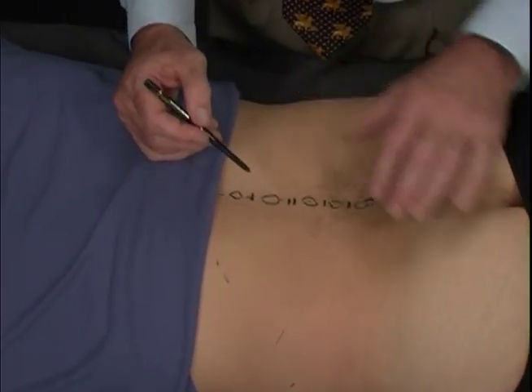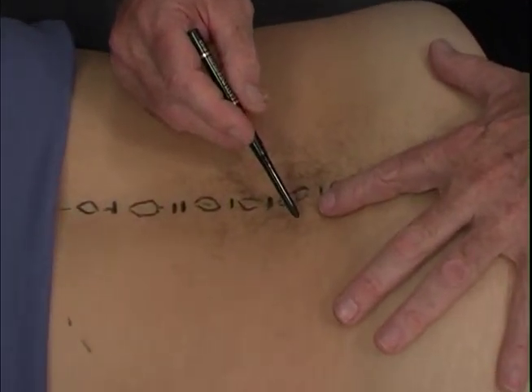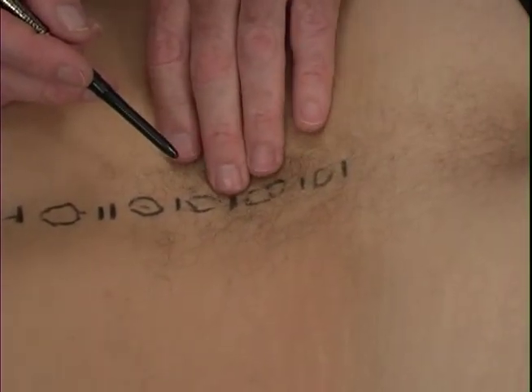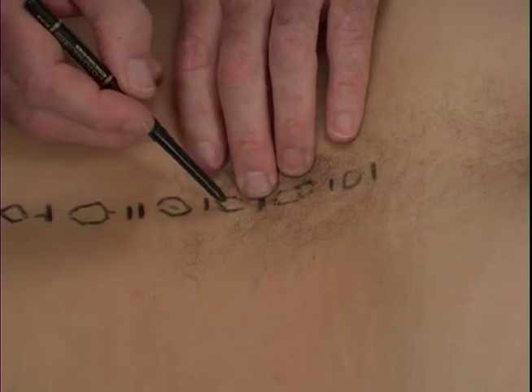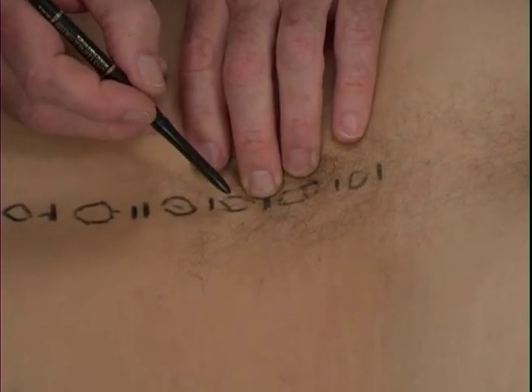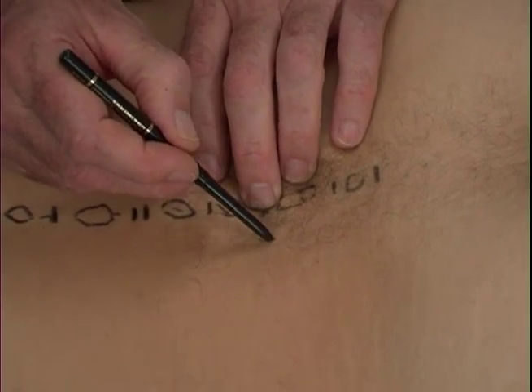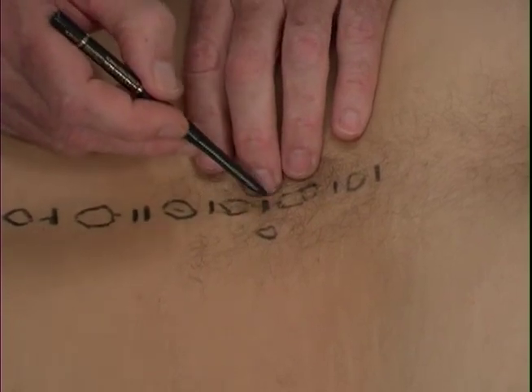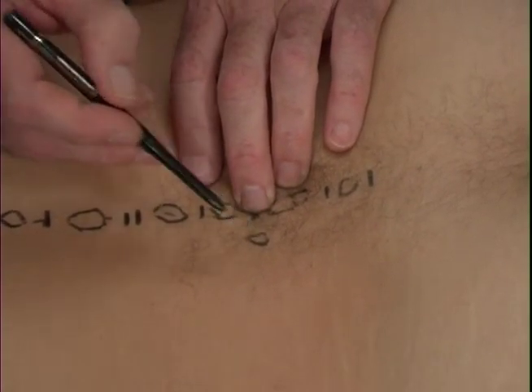Our next markings will be the level of the facets. And in the lumbar area, we know that frequently the facets align with the interspace, the space between the spinous processes. I remember this by thinking of it as space to space. In other words, space between the spinous process aligns with the space of the facet itself.